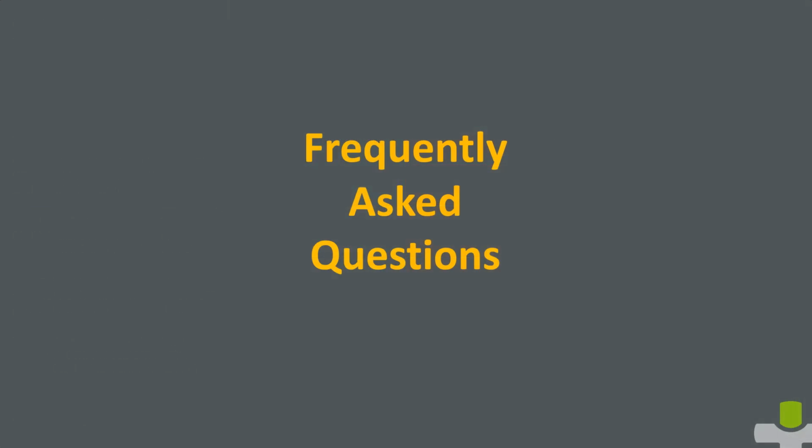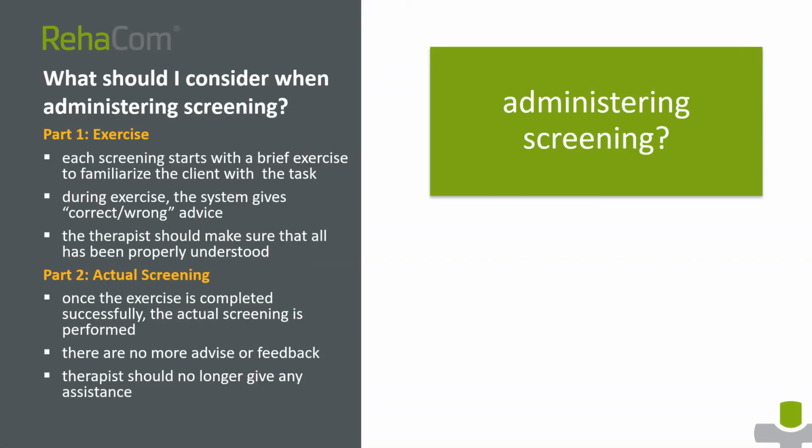Okay, now I will answer some frequently asked questions. What should I consider when administering a screening? Each screening starts with a brief exercise to familiarize the client with the task.